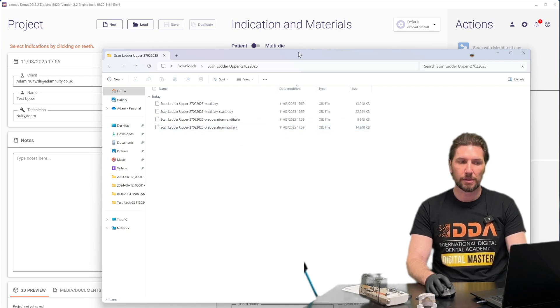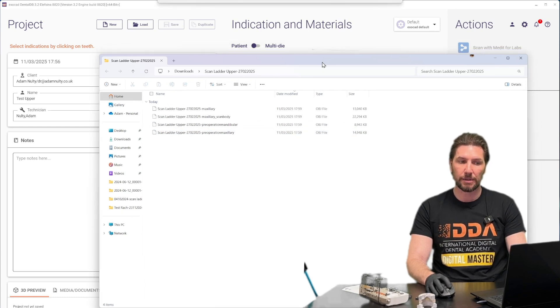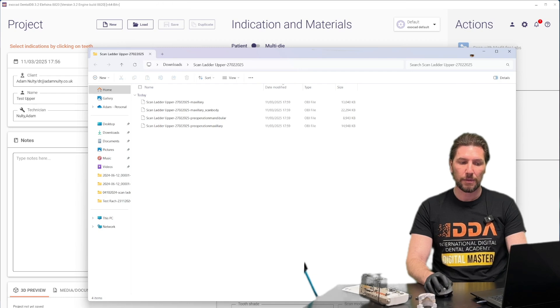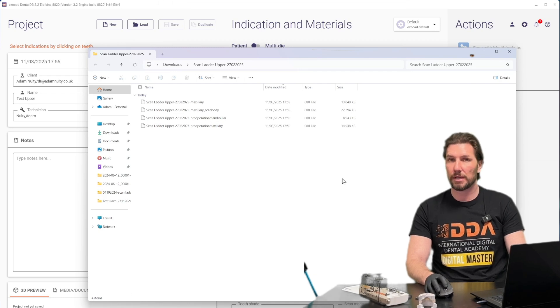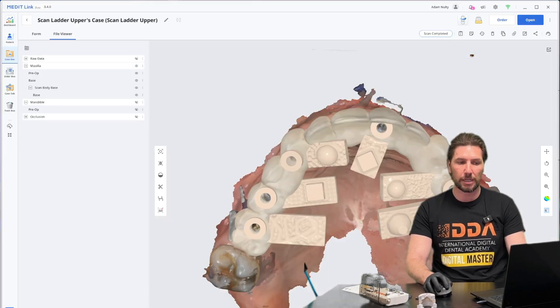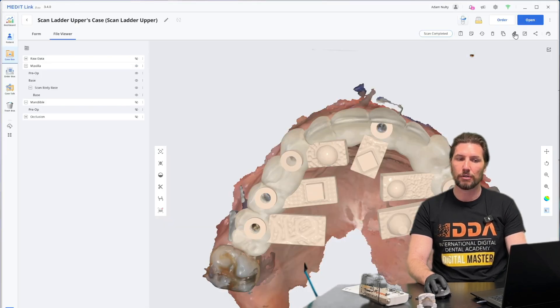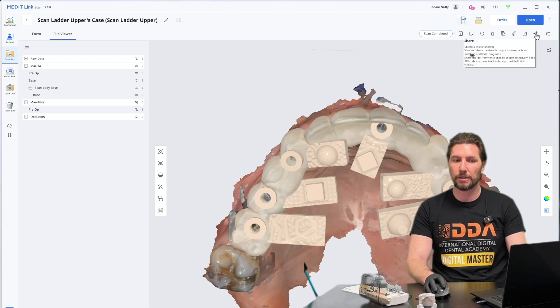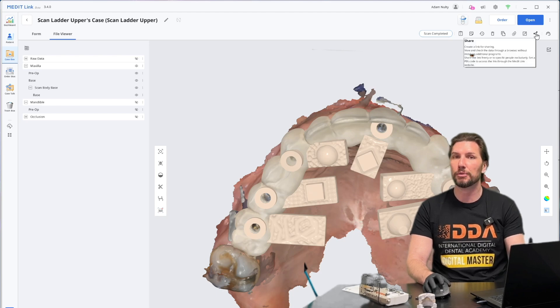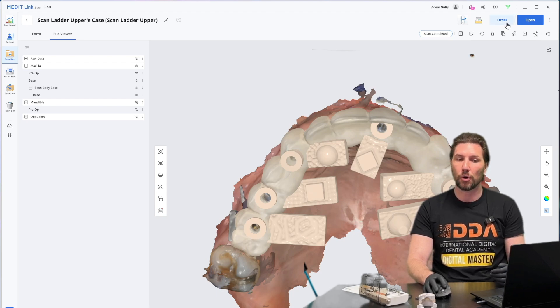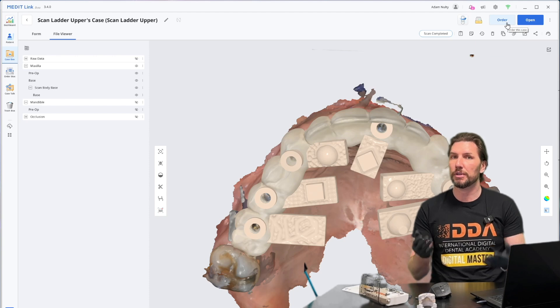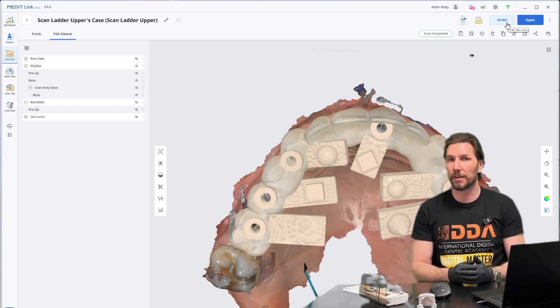Once you've got this data and you want to send it to the lab, you could send them that physical data, or you could send it directly via the share button within MeditLink, or order it from your lab and send all of that data directly.